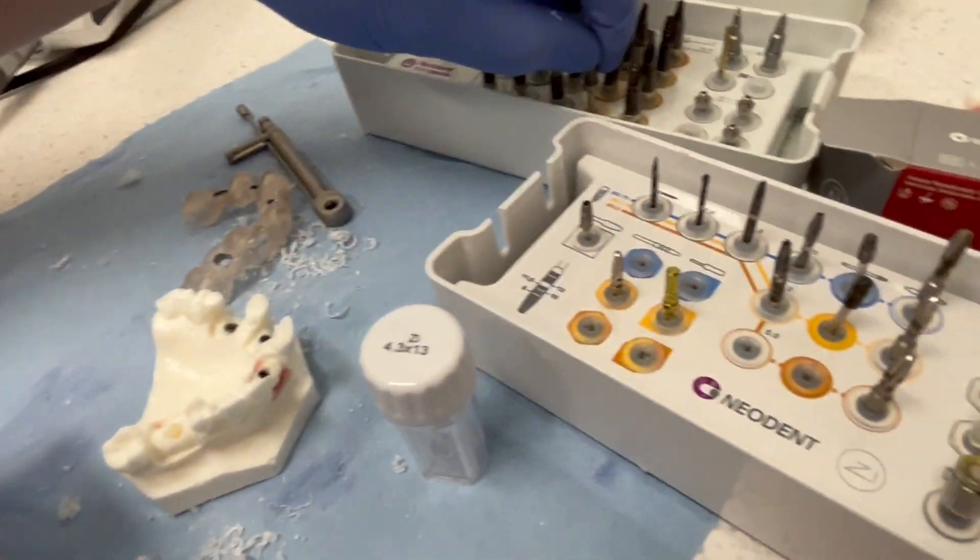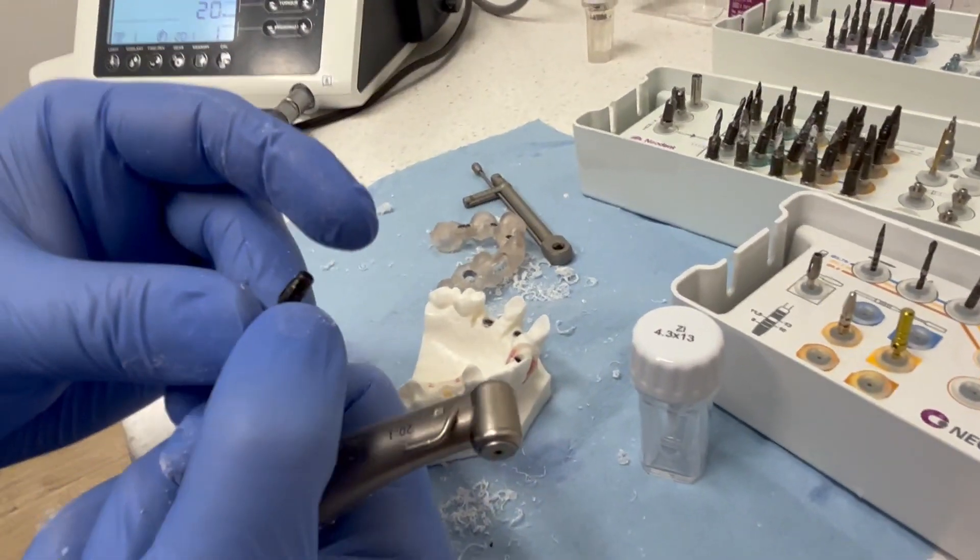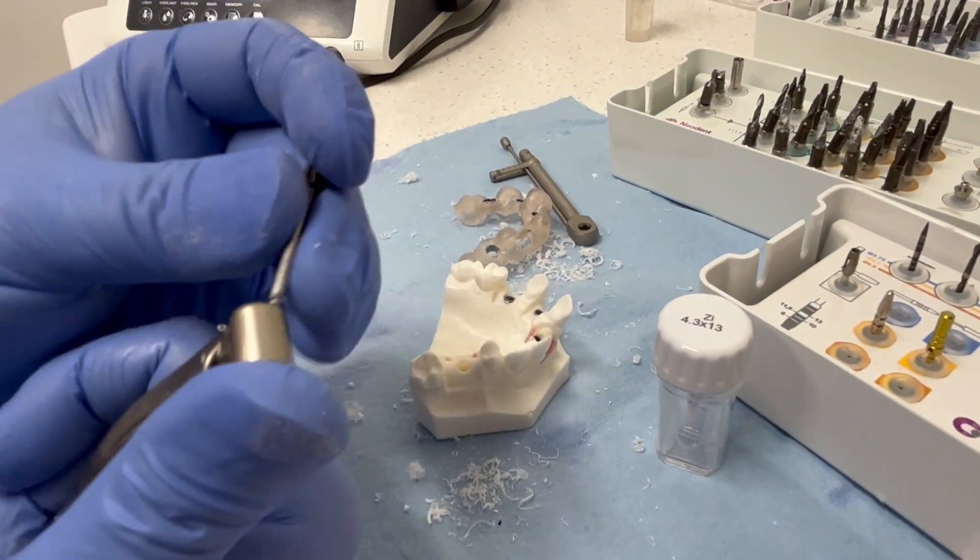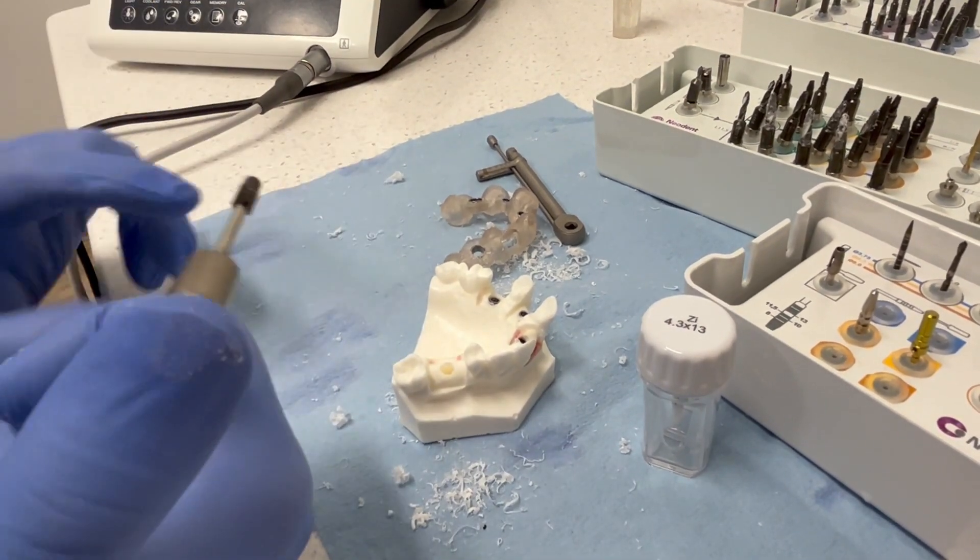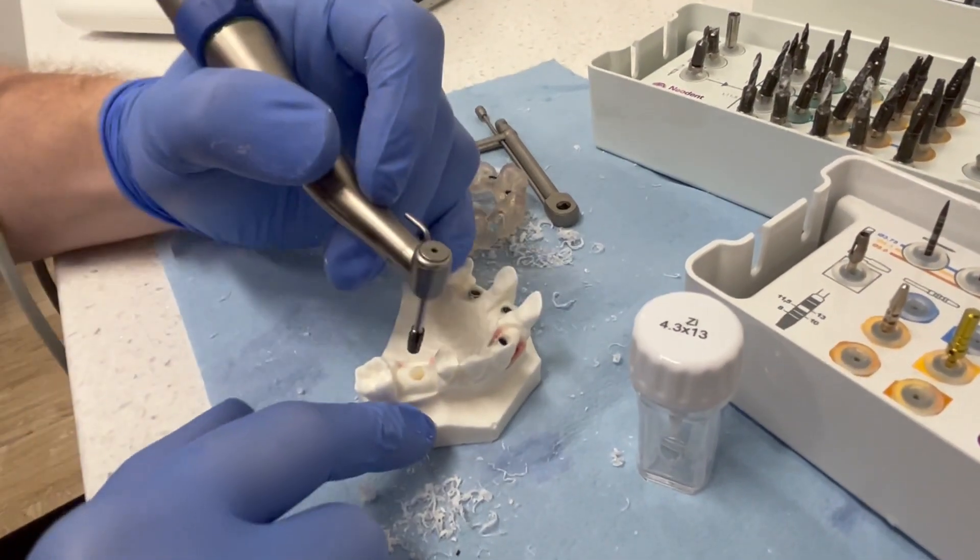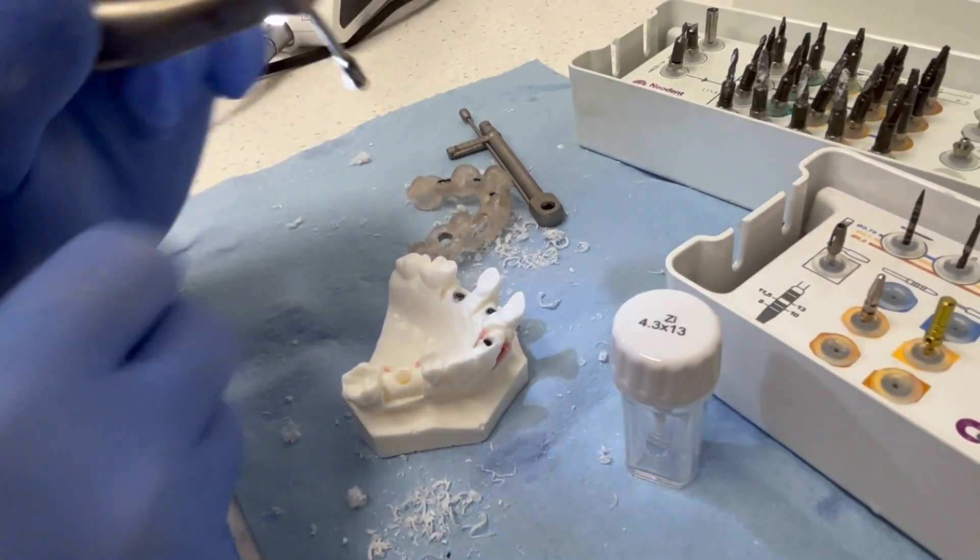And we're going to grab this bone profiling tool for the 4-3-ZI. And we're just going to take it down a little bit past that line. And all we're doing is flaring that cortical plate so we don't get hung up during our implant placement. So you'll see this fits in nicely. We'll take this down. And we flared our top.